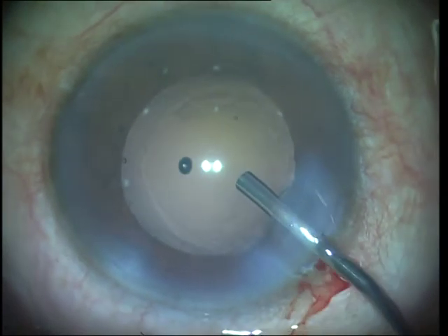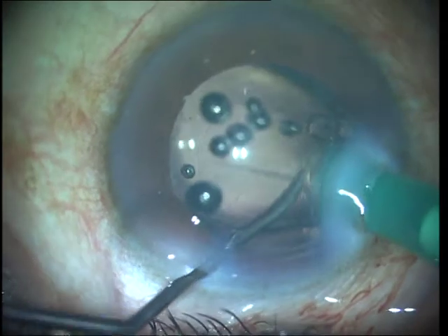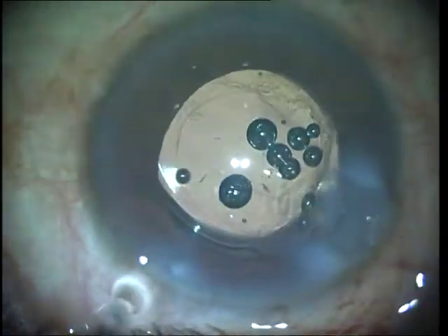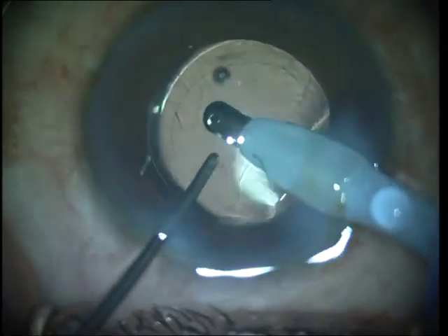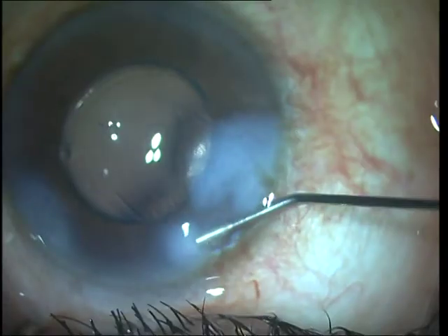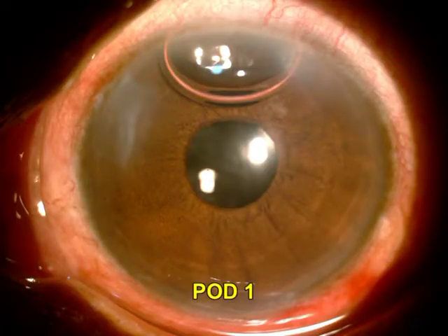The capsular bag is finally inflated well and the IOL is injected, taking care that it is directed towards the fornix of the capsular bag so that it does not snag on the lax and floppy posterior capsule and create a zonulodialysis. The post-operative day one appearance shows a very good and clear cornea.